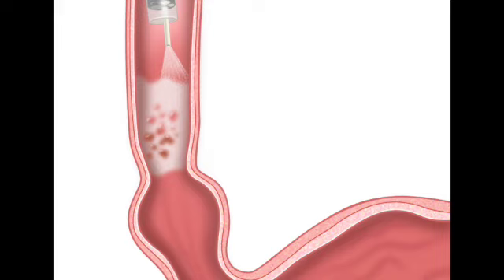The dangerous tissue is the part that loses its disguise too quickly because it's just too chaotic to hold on to the chemical reaction. And if we connect this back to the bigger picture, you can see why this fundamentally changes a gastroenterologist's job. I mean, yeah, it's night and day. These rapidly fading, non-white areas suddenly act as a high-contrast map. We started by talking about those murky diagnostic waters, right? Yeah, staring at a sea of pink tissue. Exactly. Staring at pink tissue, knowing there might be microscopic precancerous cells somewhere in there, but having absolutely no target. Because before this, what were they doing? Just taking random biopsies. Unfortunately, yes. Just snipping little pieces of the esophagus and hoping they get lucky and catch the bad cells.